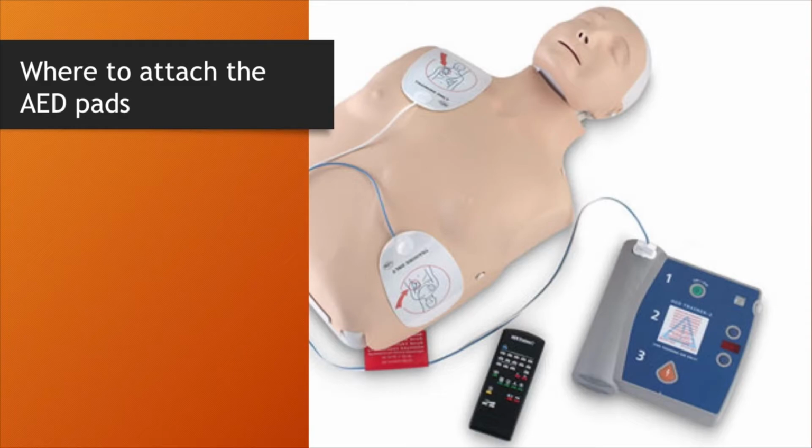Where to attach the AED pads. This picture is an example of where you should attach the AED pads on the bare chest of the individual.